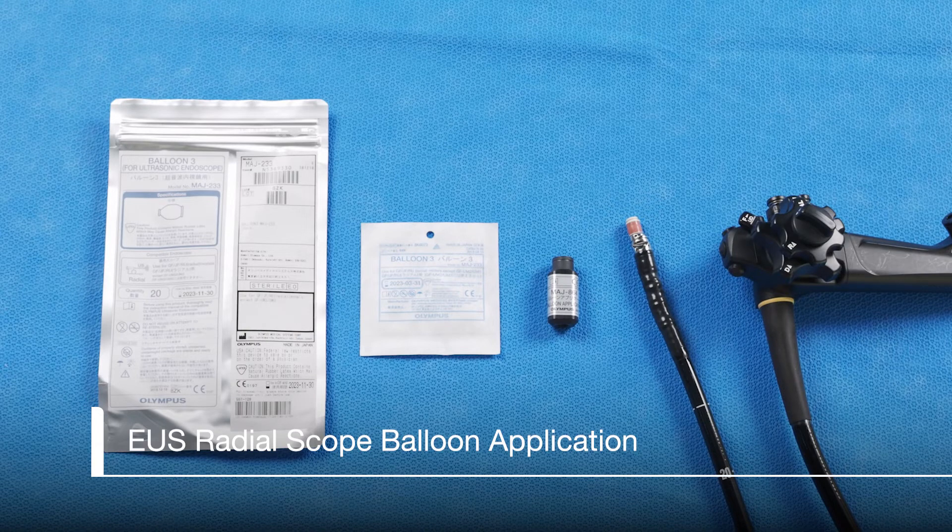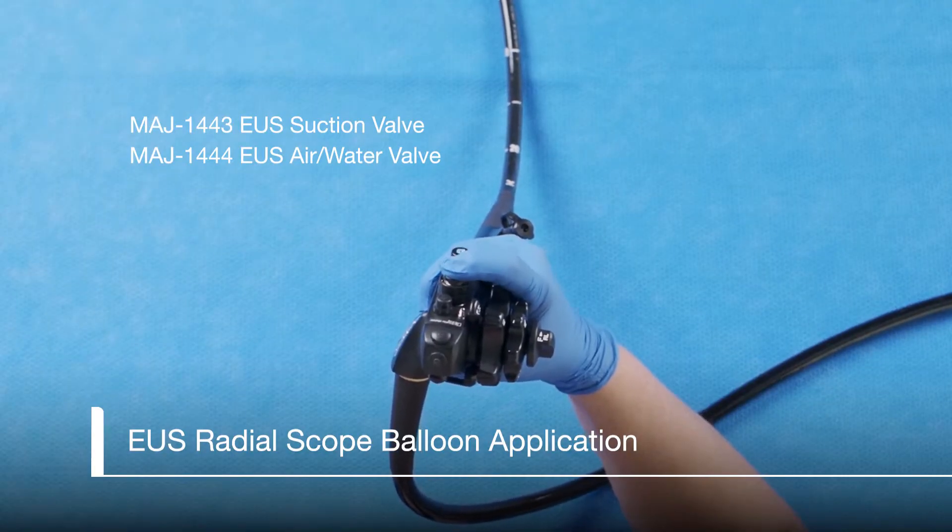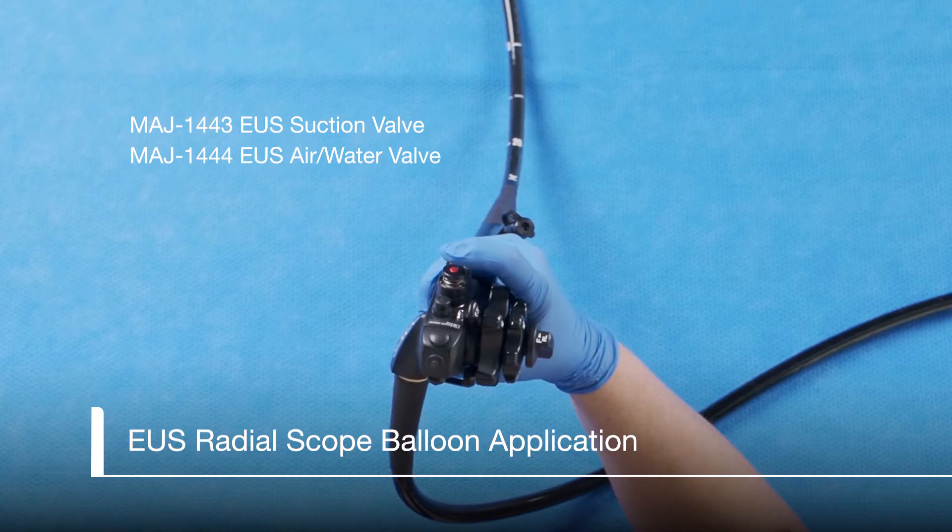This video will review how to put a balloon onto an EUS Radial Scope. We are using the GFUE160AL5 EUS Radial Scope with an MAJ864 Radial Balloon Applicator and MAJ233 Radial Balloon. Let's start by looking at the function and details of each product to ensure you are familiar with the design features and how they work.